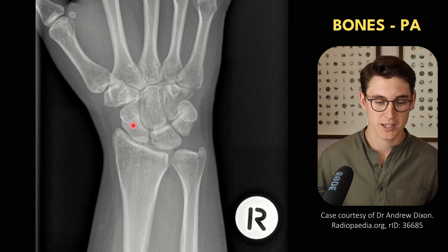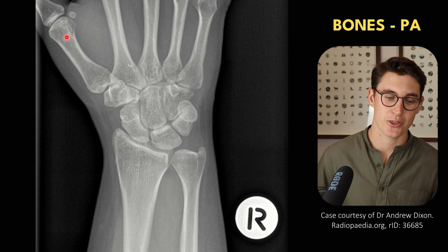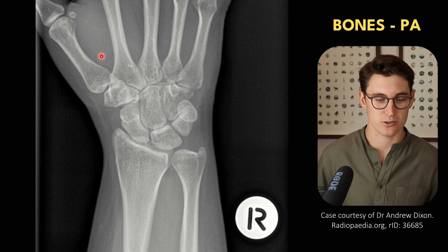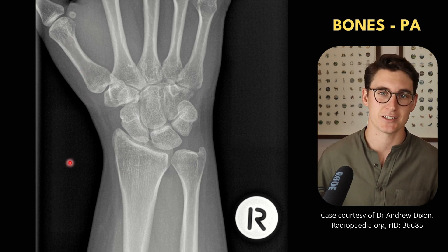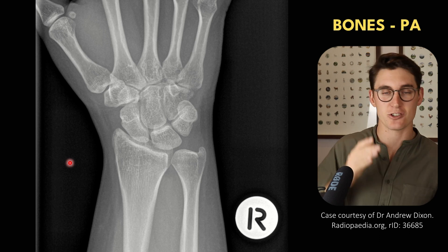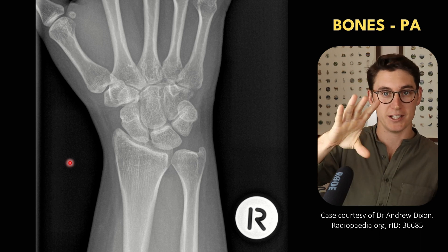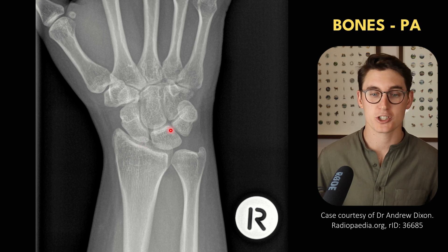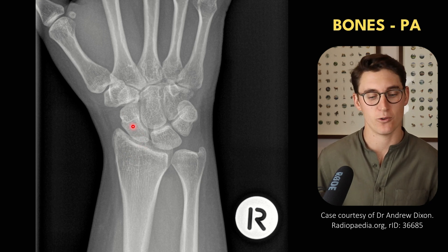Let's start by naming the proximal row, starting laterally. We can see our thumb in the anatomic position is lateral. We know that our thumb is on the same side as the radius — an easy way to remember this is that your thumb can do a radial movement, so it's on the same side as the radius. Our proximal row lateral bone is our scaphoid bone.